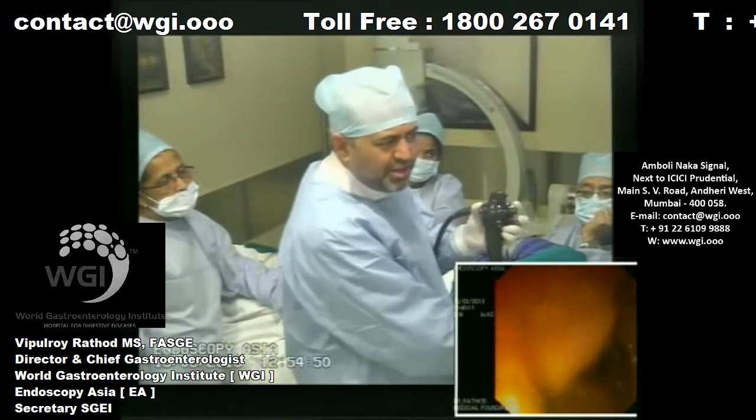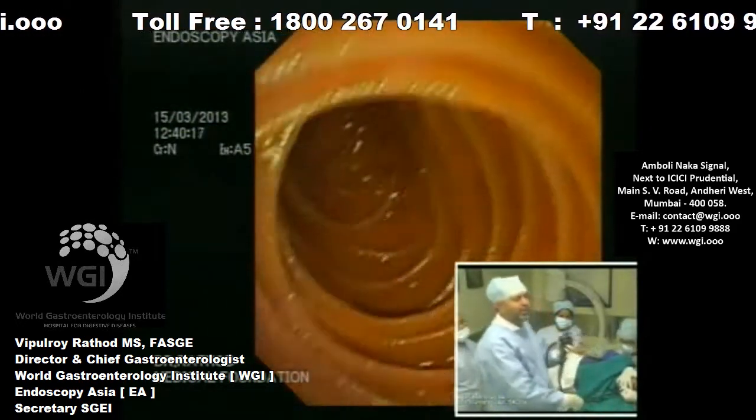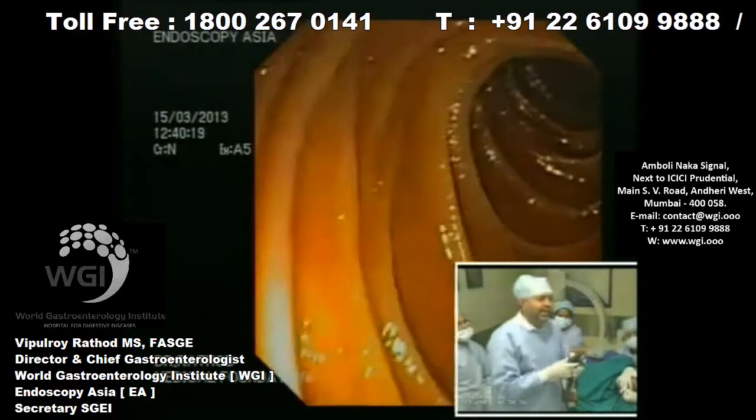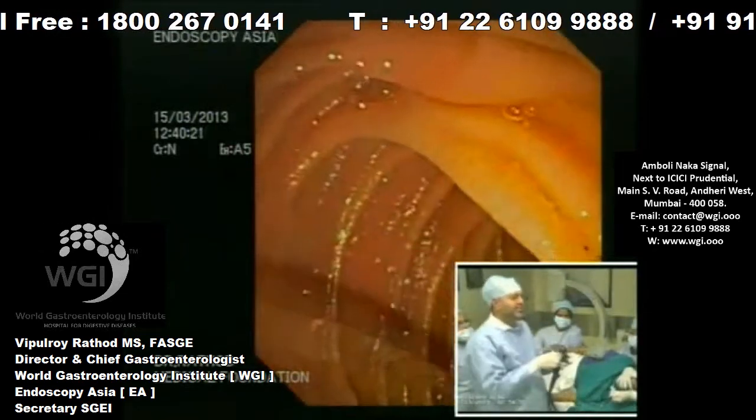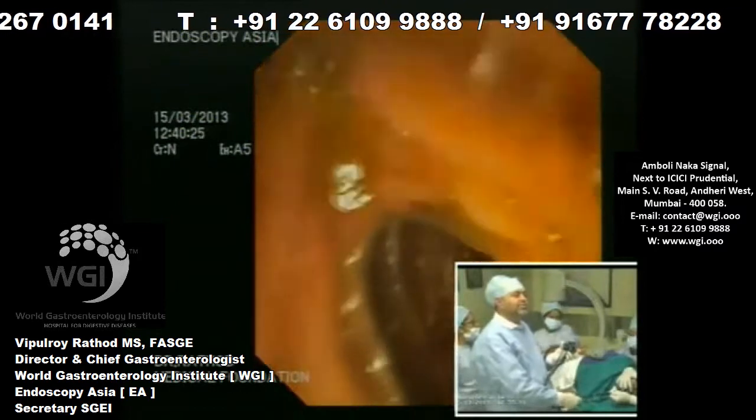I'm seeing some sludge coming out of the ampulla. Look at this, the ampulla is bulging. There's a lot of sludge coming out. So this can explain some of his symptoms. Let me see the ampulla. You can see the ampulla with this also.